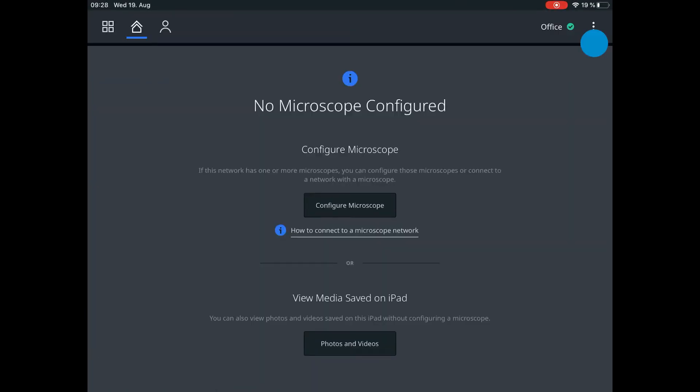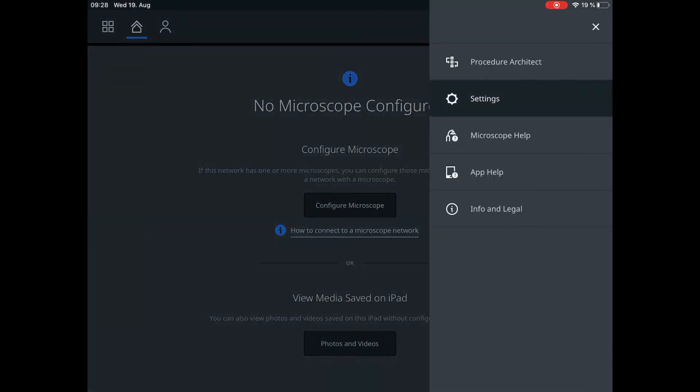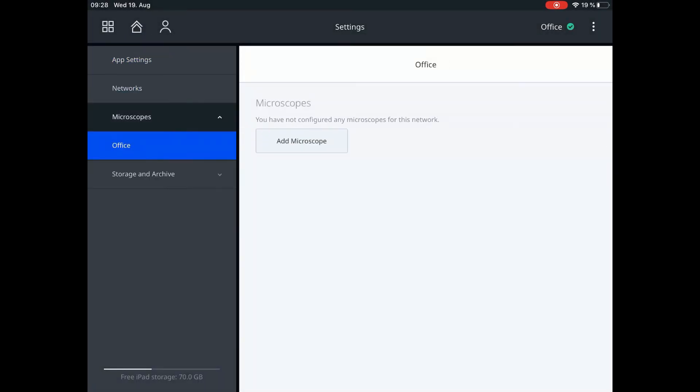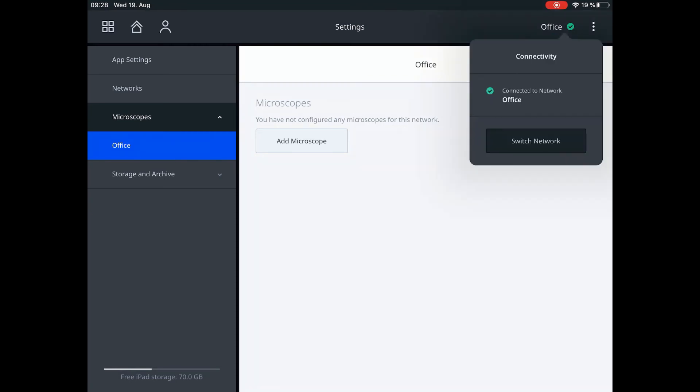Under Networks in the Settings menu, you can either configure a storage that is located within the network or you can add a microscope in case this is connected to the practice network as well. A new network can be added easily by clicking on the toolbar on the upper right side.